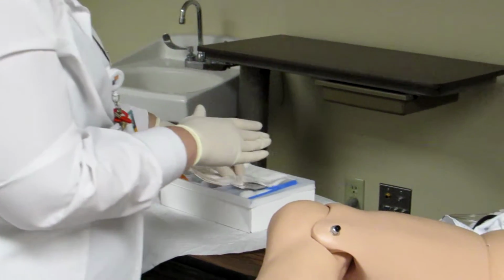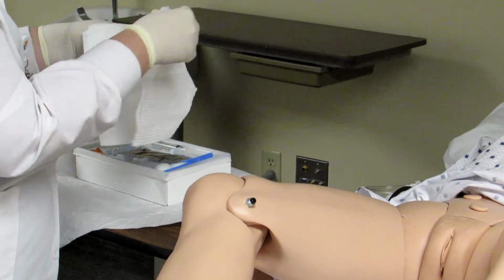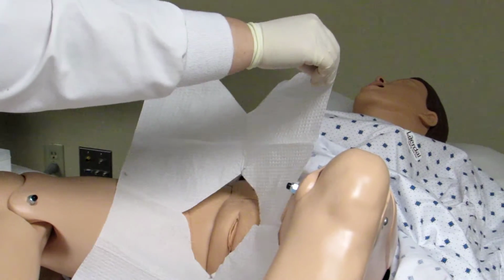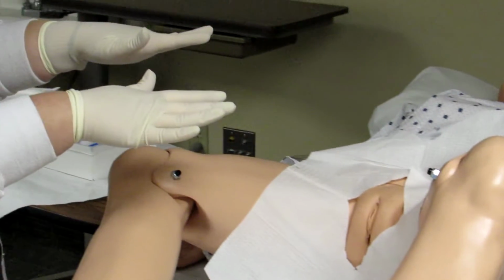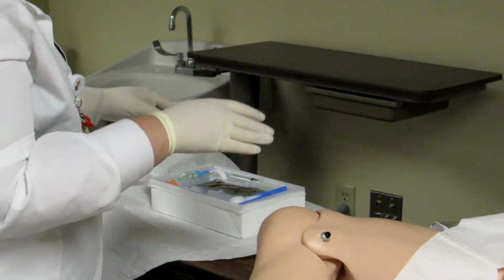I have my second drape I'm going to put on. It's going to go right over the perineal area. And again, remember, these gloves are sterile, so I may just kind of have to drape this on here the best that I can, making sure that I don't touch any of the areas that are not considered sterile. Now I have exposed my perineal area very nicely.